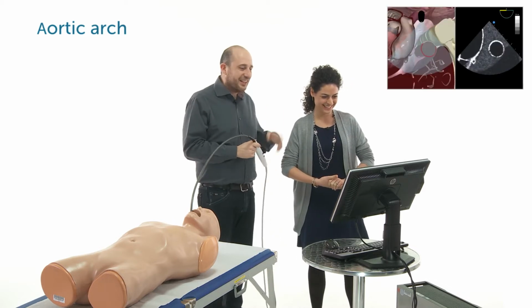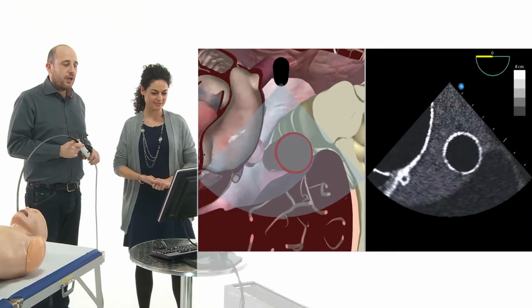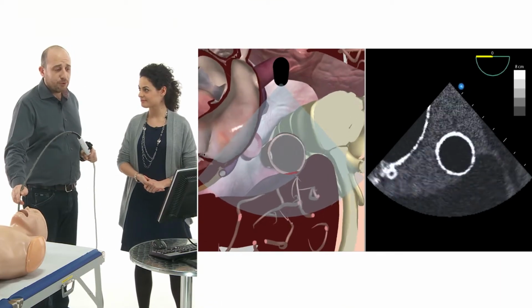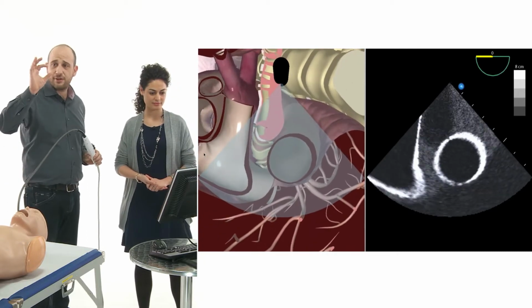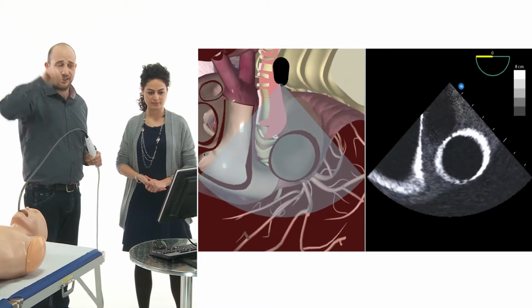You are right. So, how do we get the aortic arch? If we are on the descending aorta, we have to pull out the probe till, from a circular cavity, we see an elliptical cavity.